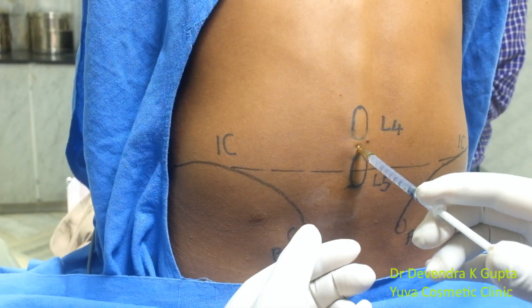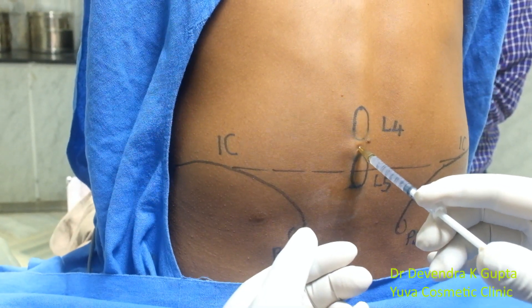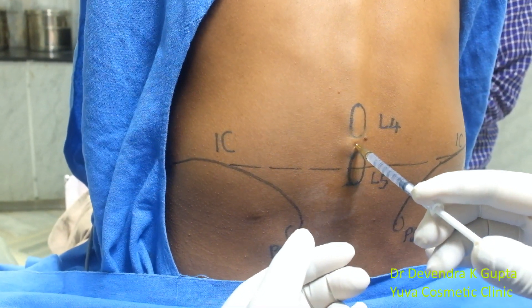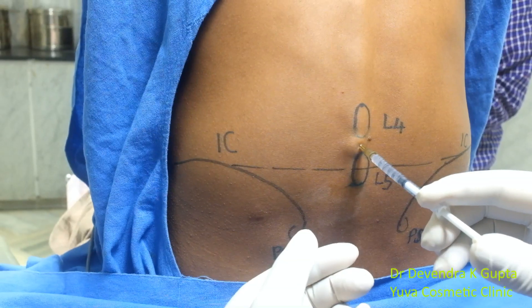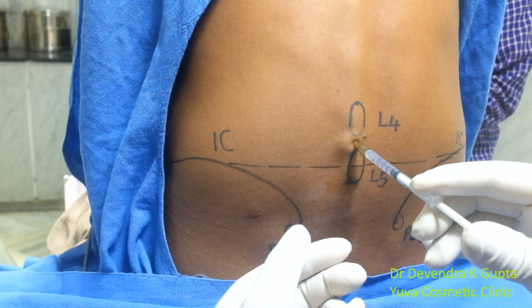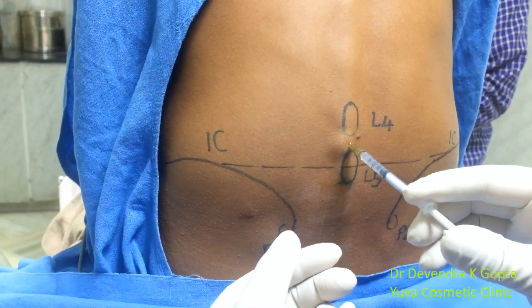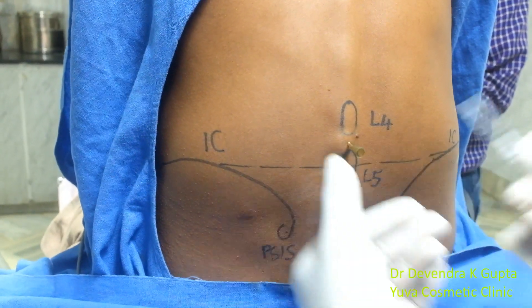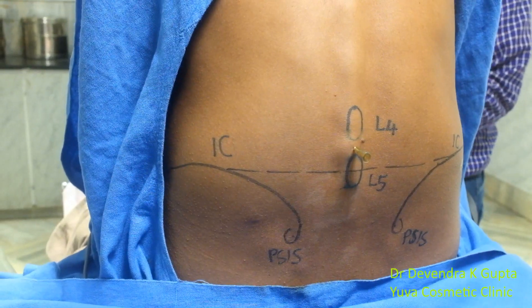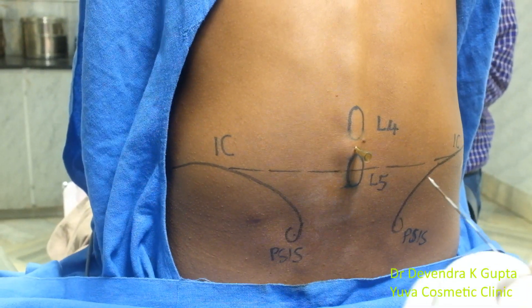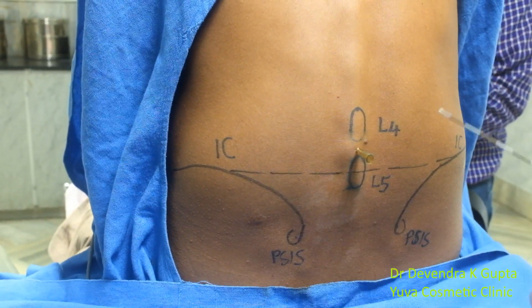I inject 1 ml of the solution here and remove it. I have now taken the epidural needle.